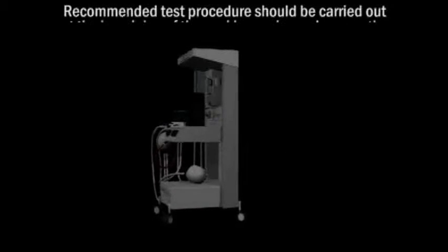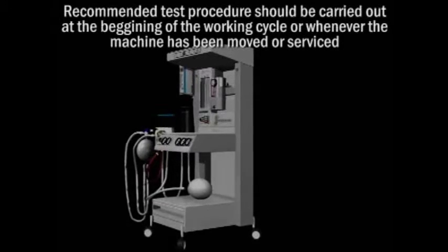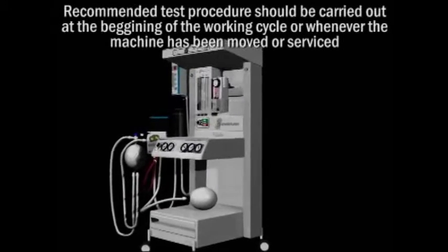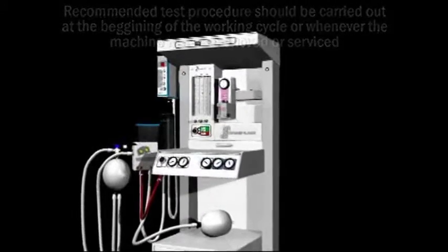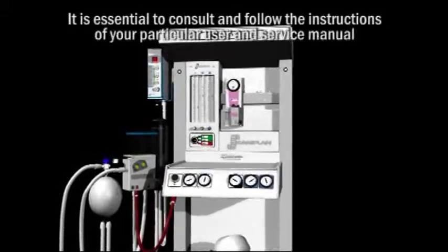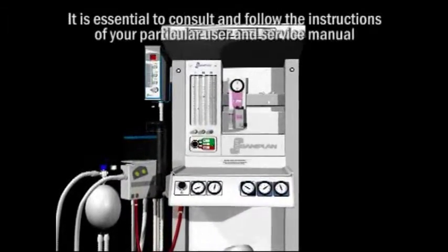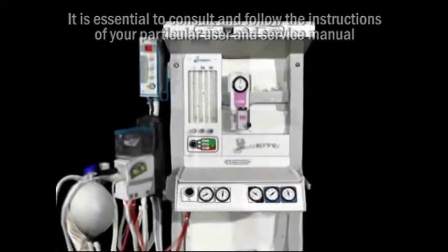Test procedures. The following recommended test procedure should be carried out at the beginning of the working cycle or whenever the machine has been moved or serviced. The procedures are considered in general and may vary depending on the equipment configuration. It is essential to consult and follow the instructions of your particular user and service manual in order to assure the proper and safe operation of the equipment.